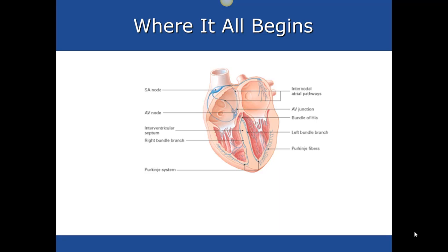The rhythms are classified according to the heart structure in which they begin, or their site of origin. Sinoatrial node, or the SA node, fails to generate an impulse. These atrial tissues or internodal pathways may initiate an impulse. These are atrial dysrhythmias. Rhythms generally are not considered life-threatening or lethal. However, we must provide continuous assessment because they could indicate other problems.